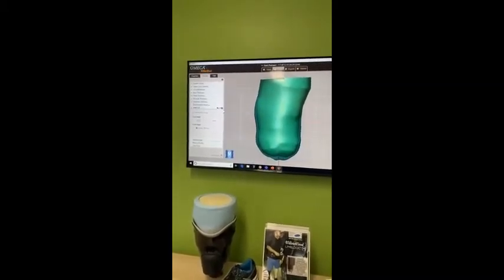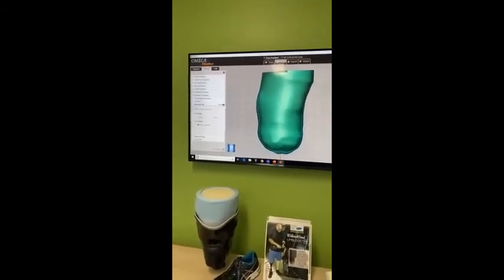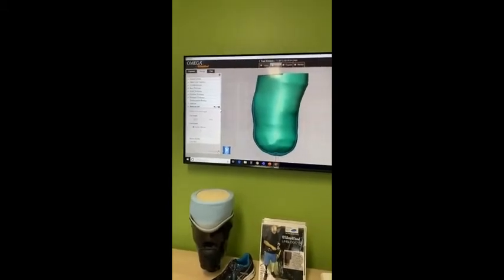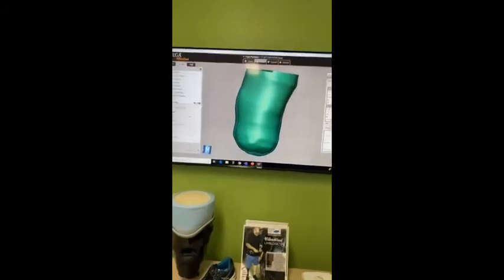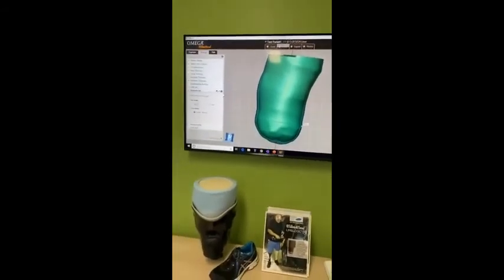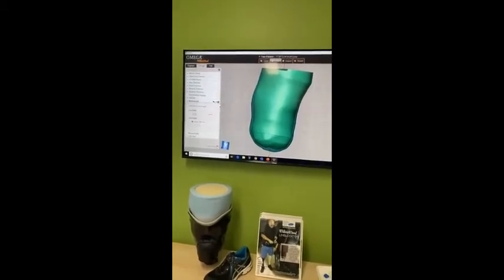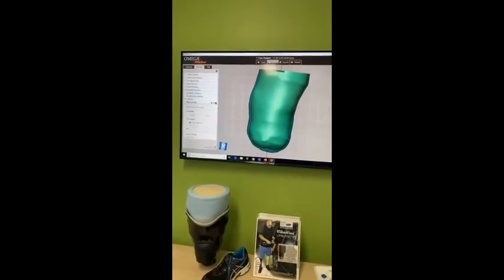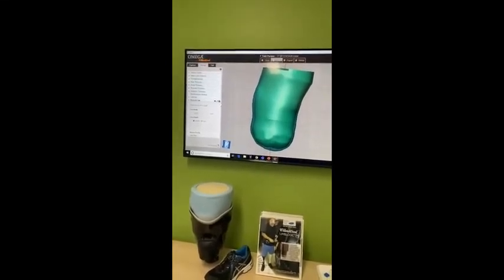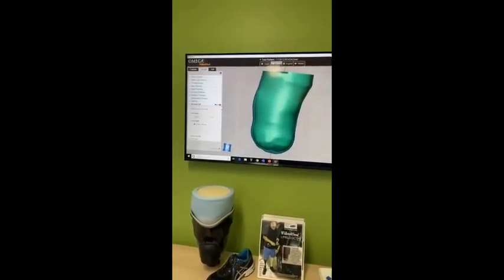And then we can also remove gel to fix those points up, just to make that area a more uniform shape. And take the back wall down more.